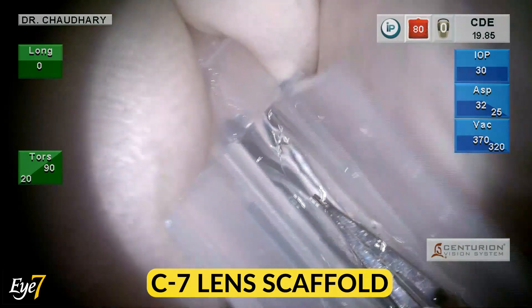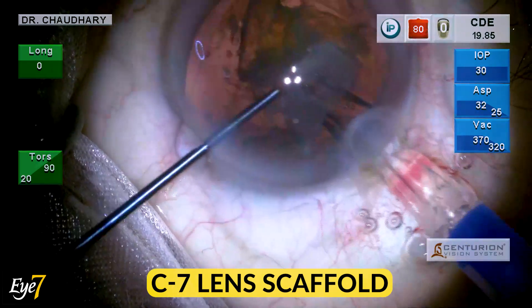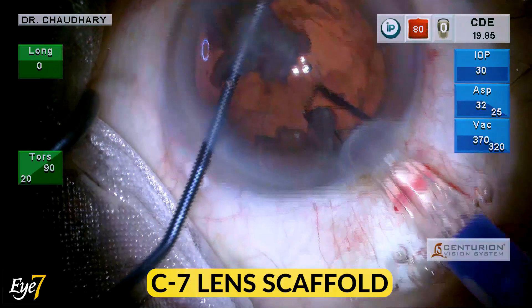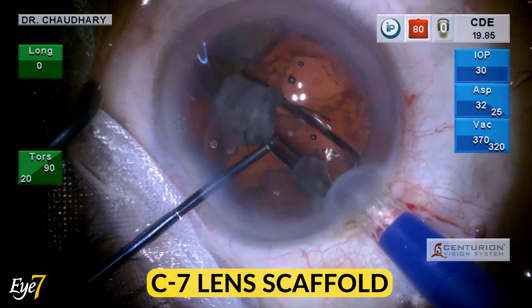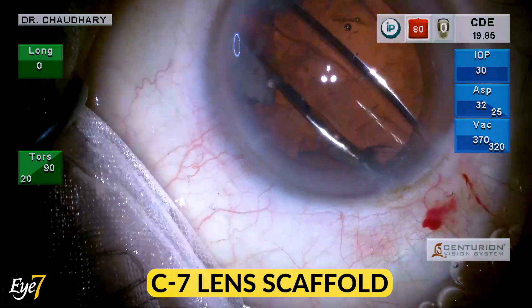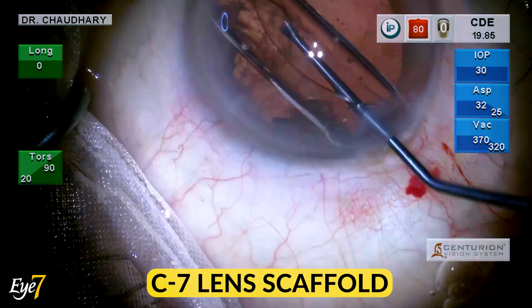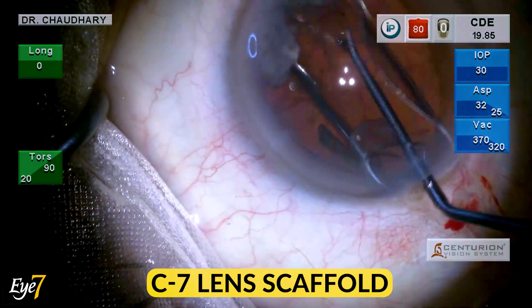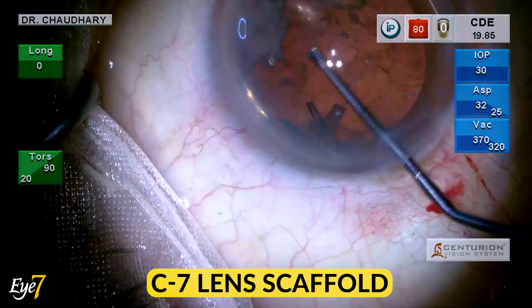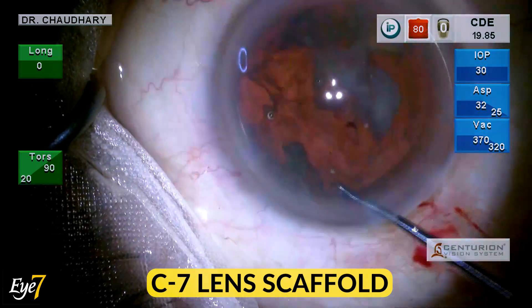This is loaded into any IOL cartridge and injected into the eye through a normal 2.8 millimeter incision, in such a way that it opens up over the iris. Once it has opened up, as you see in this video, the nuclear pieces are guided over the lens scaffold.